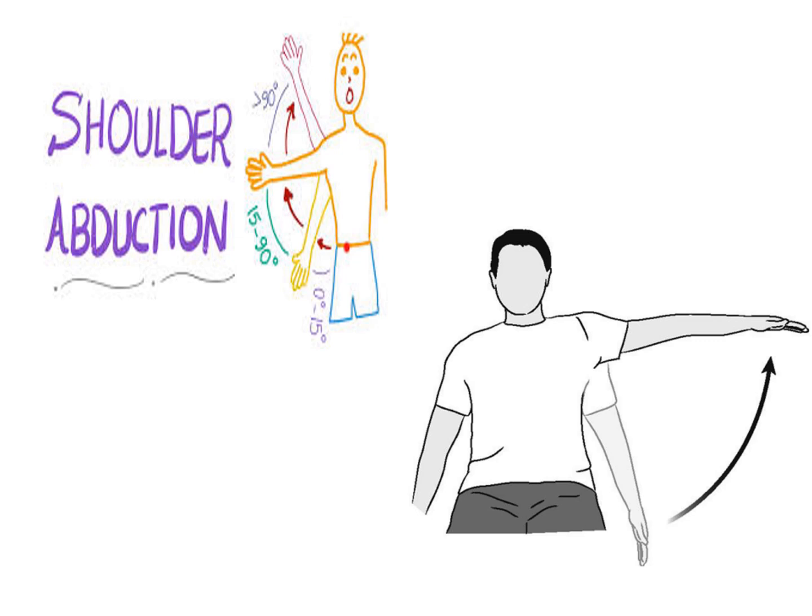When you ask the patient to take the limb up in the frontal plane, that means sideways, not frontways, sideways, up above till your head level, that is known as shoulder abduction. The complete range of motion of shoulder is 0 to 180 degrees. Okay, so the first figure is telling you about shoulder abduction.